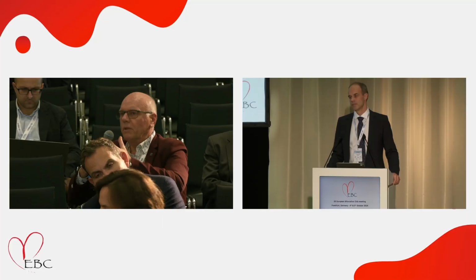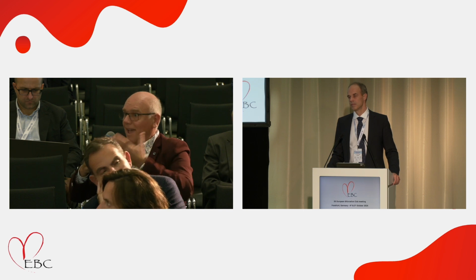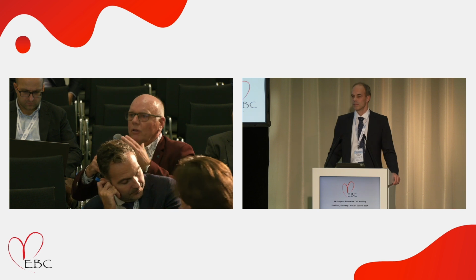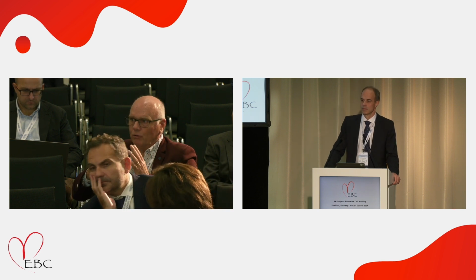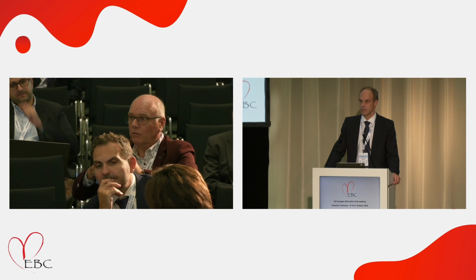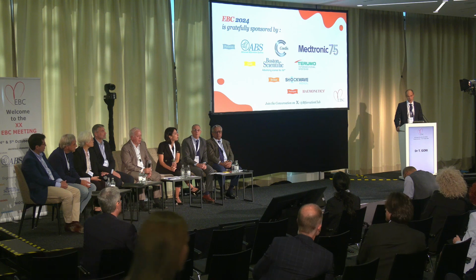So DK crush was developed to allow and permit very high rates of final kissing. If you do enough of these, or your shunt, your reverse flare, you do get a heterogeneous result and it can make it very hard to do the final kiss, without doing the first kissing with DK crush. So it's just a comment, not a criticism. Yeah, no, I do agree with you. A fair comment.